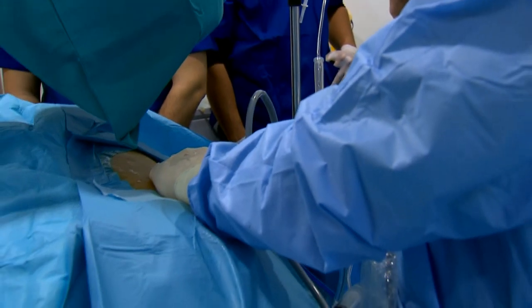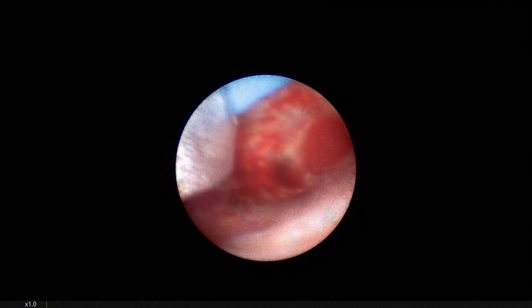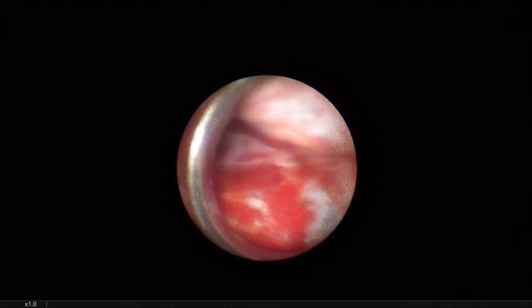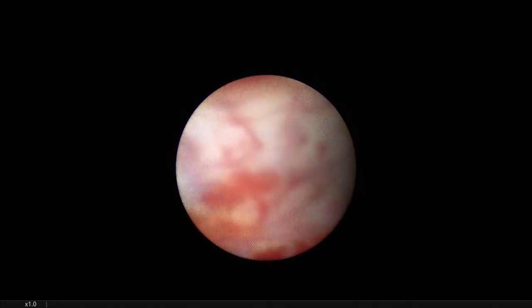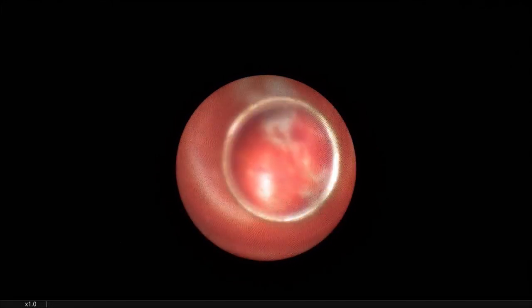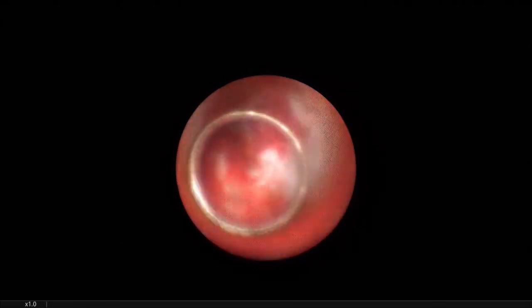We have to draw the balloon catheter. Always turn the Amplatz sheath around. No stone. This is a middle calyx. And we are removing the Amplatz sheath slowly to the lower calyx. Slowly. Always turn it around.